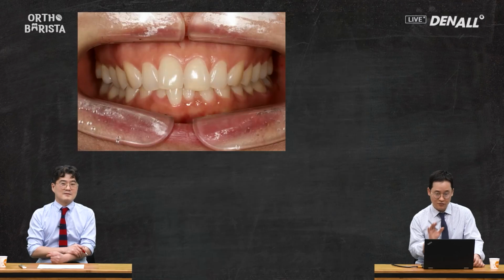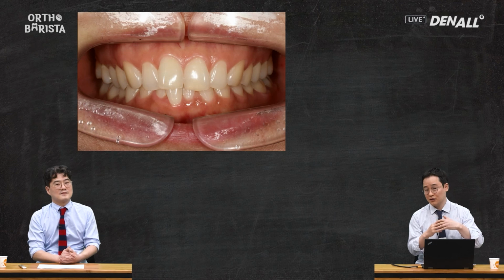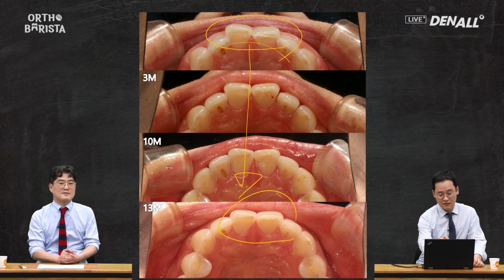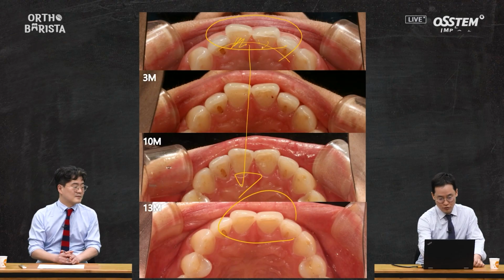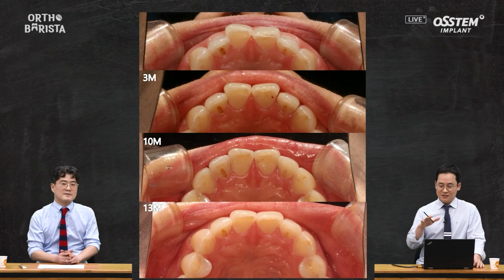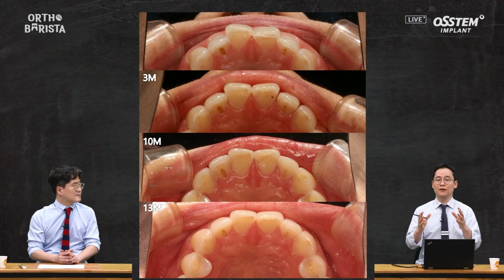In this case, the patient had a deep bite with tight occlusion, which likely caused the mandibular anterior teeth to continuously interfere with movement. For rotational movements, it's important to consider opposing teeth. For instance, lingual surfaces may show wear, and such patients often experience difficulty achieving proper rotation. Mandibular-related considerations are sometimes overlooked in clinical practice, as patients tend to keep their mouths open, and we primarily focus on whether the aligners fit well or if alignment appears correct.